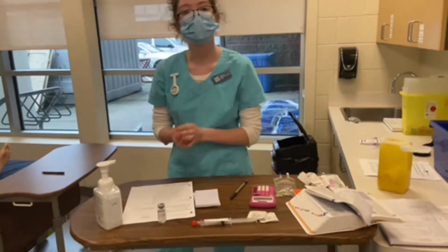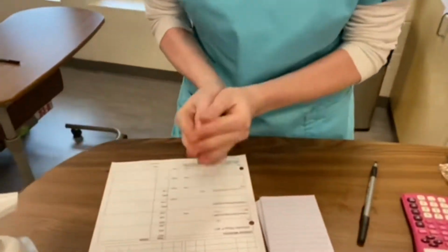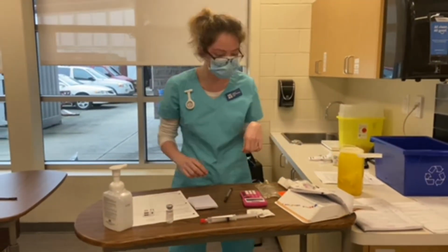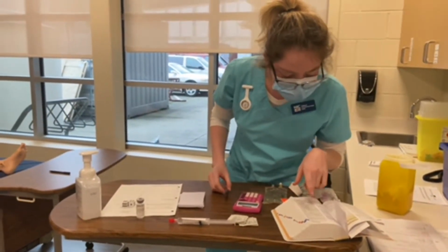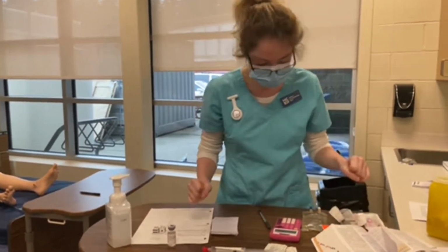To start, I'm going to roll dice to find out which antibiotic I'm giving. And that is 9. And so I will be giving cefuroximine. So I find it in my drug book, and I dilute each 750 milligrams with 8 milliliters of sterile water.